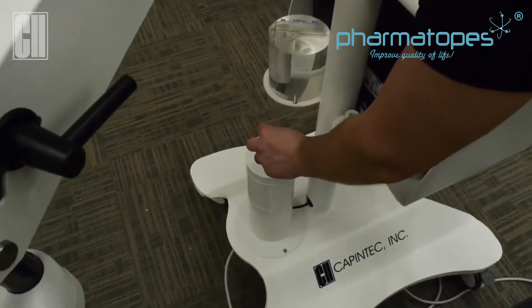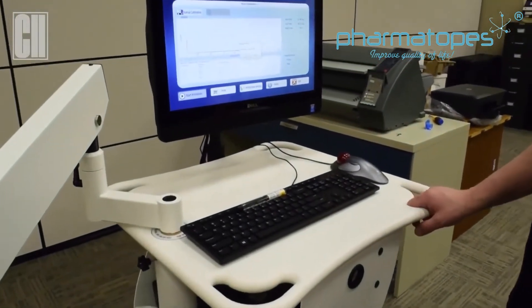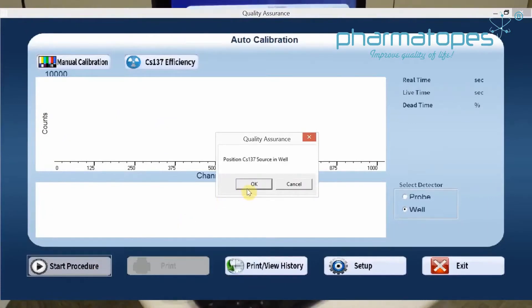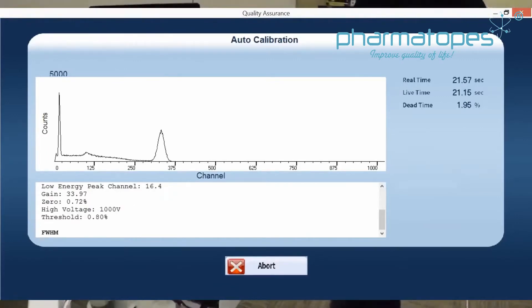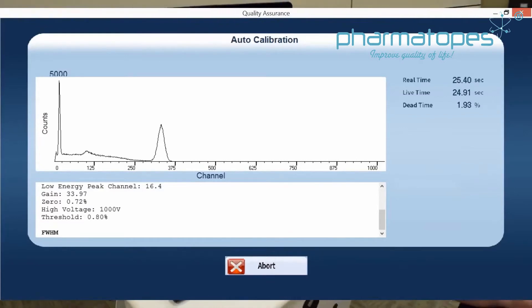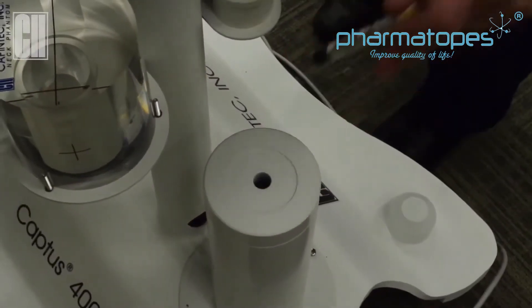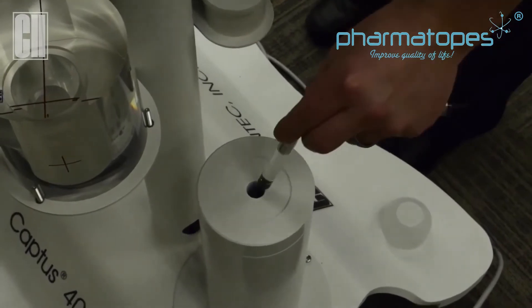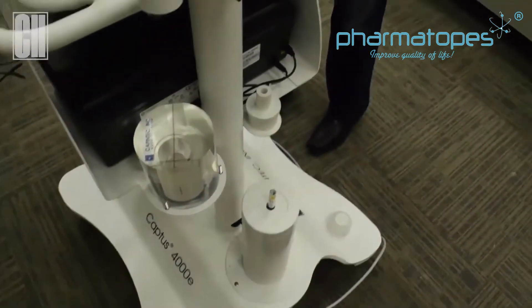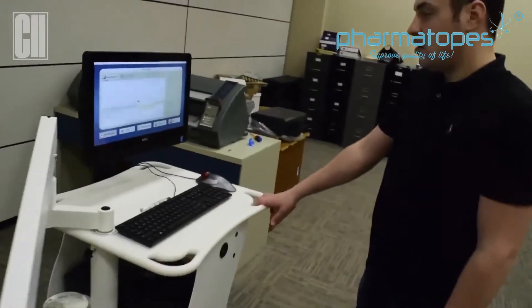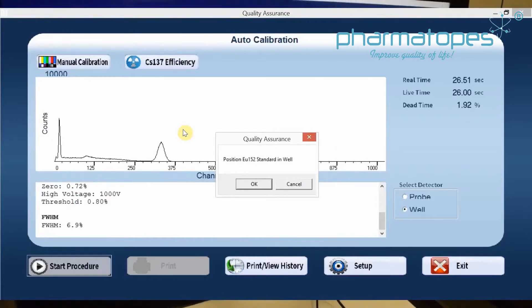Again, we want the black tip down — place it into the well. Once the source is in place, click OK, and we'll do the calibration on the well. Once the calibration for cesium is completed, we're going to do linearity on the well detector. Now that the calibration is completed, we're going to do linearity with europium. Remove the cesium source and position your europium source into the well, black tip down. Once in position, click yes to linearity, and then OK to start the calibration.